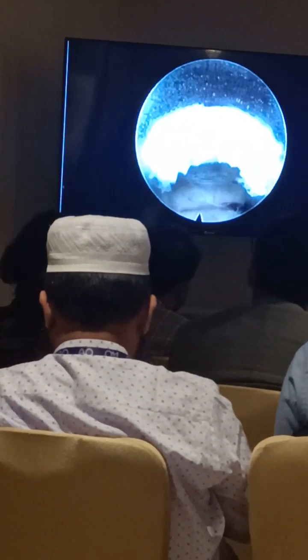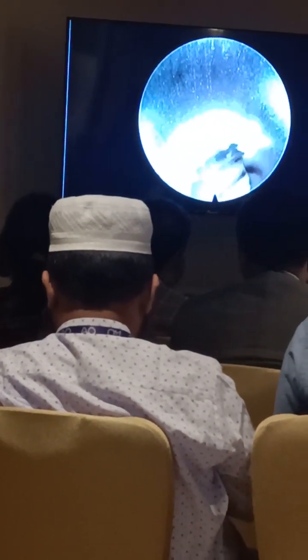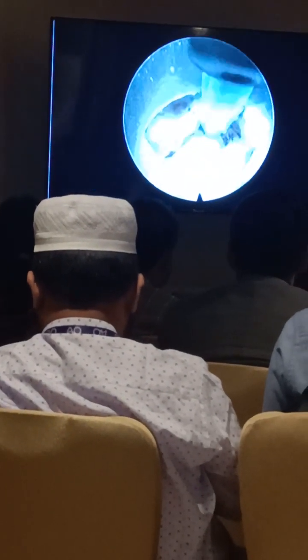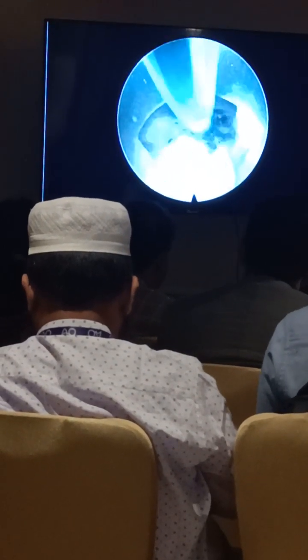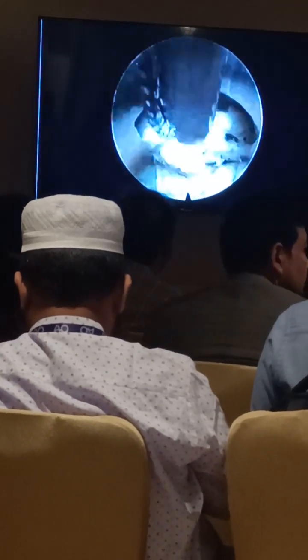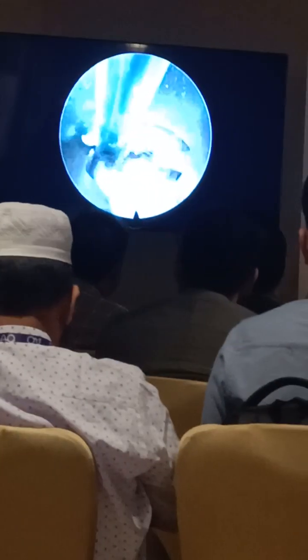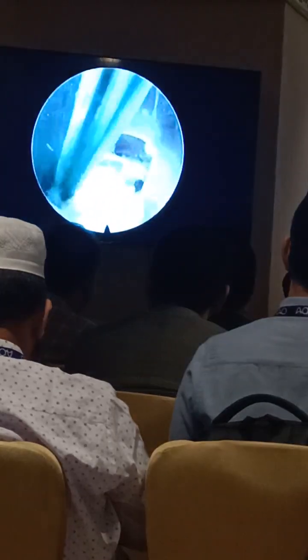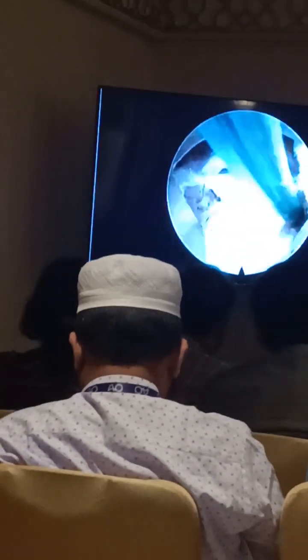And then we just slide in our sleeve, just this much rent is enough, because of the stretchability of the ligamentum flavum, our working port just dilates it. This is clearing of the epidural fat which is covering the neural element. And just a grasper to grasp this epidural fat, and you can see this is the dura which has now started becoming visible, and this is the special RF which we can even use near the dura. And you can see the dura is now becoming visible there.